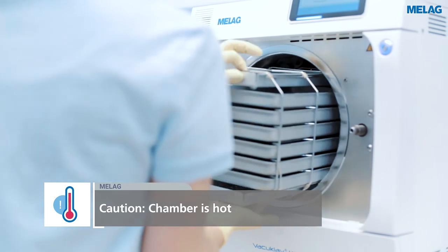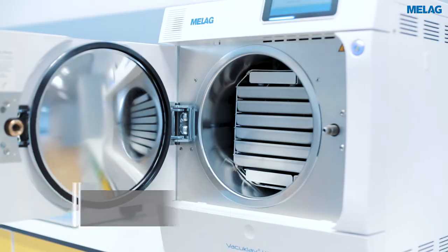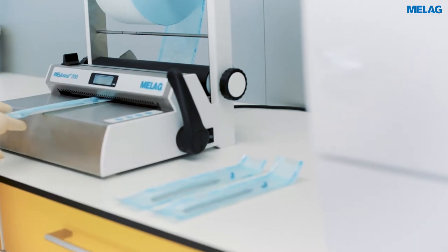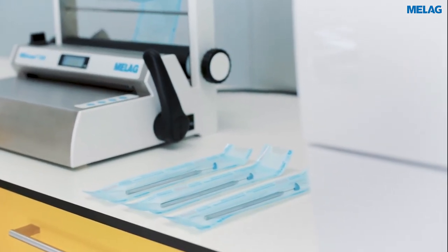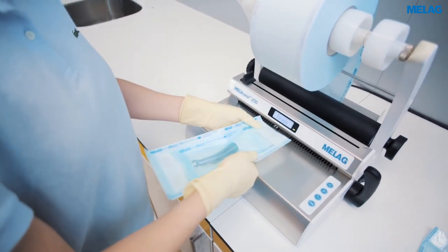Please slide the mount into the chamber until it locks on the rear panel. Surgical instruments must be sterilized wrapped. The fractionated vacuum procedure of the Evolution series even allows the sterilization of multiple wrappings.